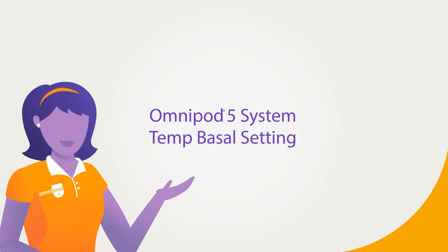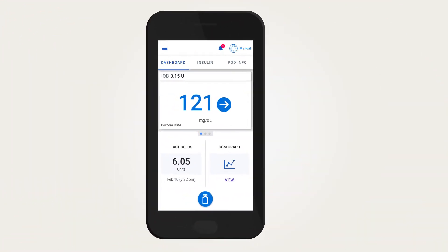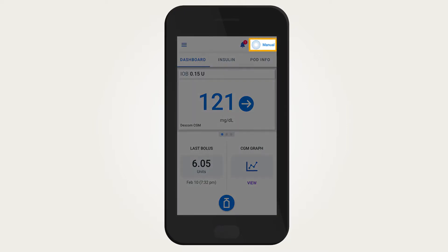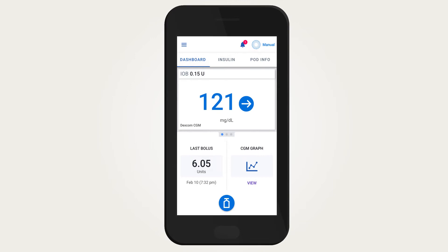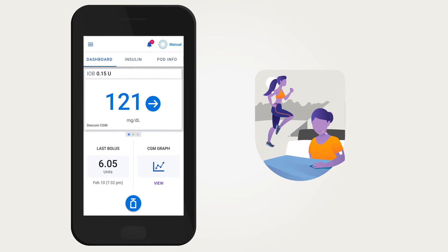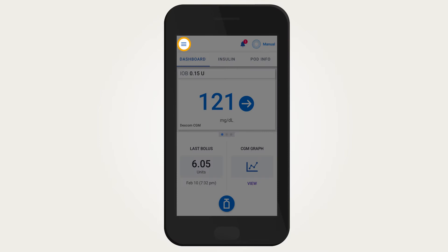In the Omnipod 5 system, setting a temp or temporary basal rate is only available in manual mode. Setting a temp basal can be used to handle a temporary change in basal insulin needs, such as activity or illness. To set a temp basal, tap the menu button on the home screen.